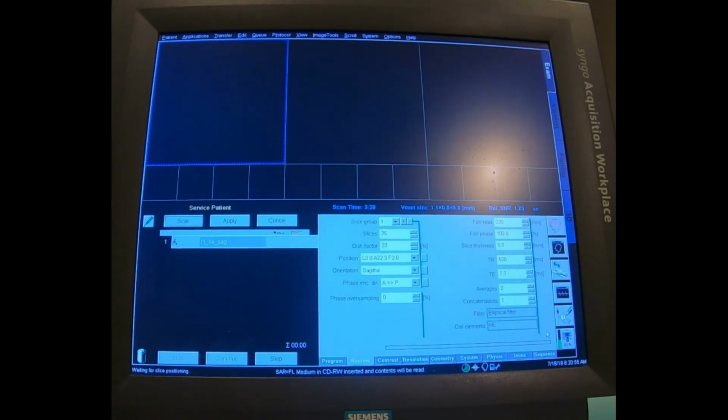The TALES is supposed to be replaced every 2 years, and it also needs to get tuned up at least once a year, just to verify that the directional coupler in the RFPA and the directional coupler in the TALES match, and that they're giving the correct numbers to each other, saying I'm giving out 10,000 watts. Yes, I'm receiving 10,000 watts. The patient is getting 10,000 watts to flip the proton, etc.